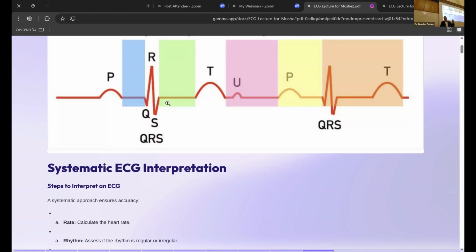If it's the left artery or the right artery or the inferior artery, we can produce a very clear and reliable image of which part of the heart is damaged. So one thing that we can diagnose with an ECG is ischemia and infarction.